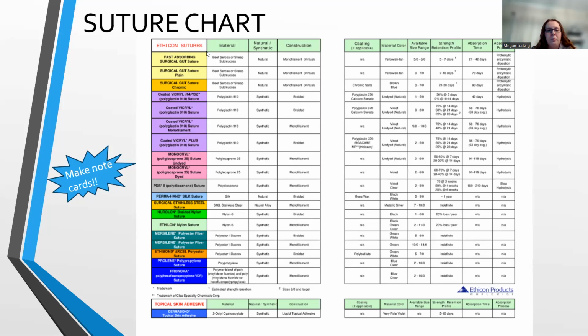That is the brand. There are other companies that make other sutures that are very similar to these. So with Ethicon, you have Vicryl, and I think it's Covidien that has something very similar, really comparable to Vicryl, called Polysorb. So you're going to see both of those. Actually, in most facilities, they'll have both because some surgeons just prefer Polysorb over Vicryl, even though they really do the same thing. They're made the same way. They have the same absorption, it's surgeon preference sometimes.